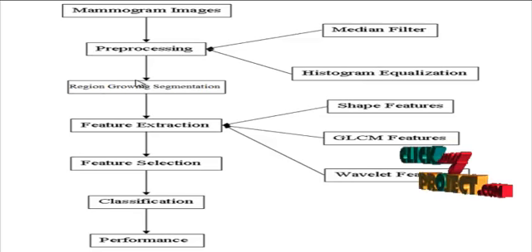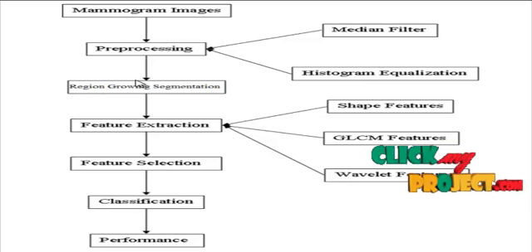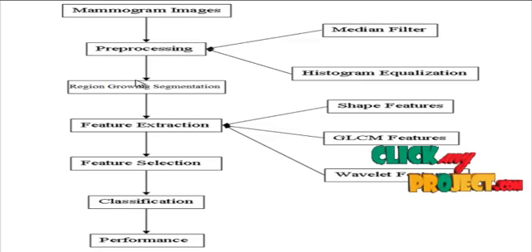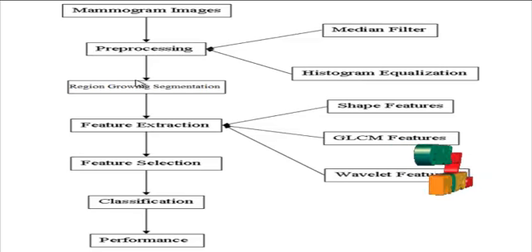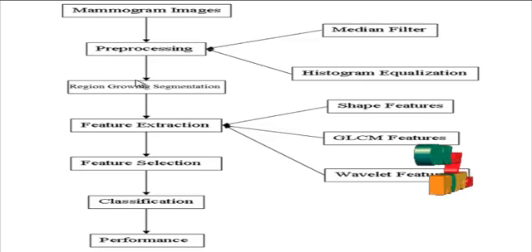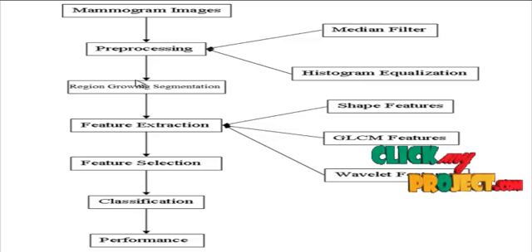After that, segmentation is employed using region growing segmentation. In region growing segmentation, the pixels that have similar intensities compared to the specific regions were obtained, so that those pixels alone were segmented from the images. The mammogram masses were somewhat higher in intensity compared to the other regions. So based on that, the regions were segmented.